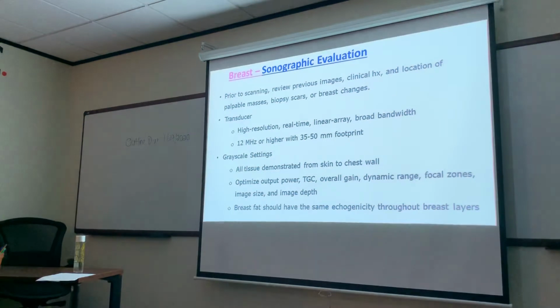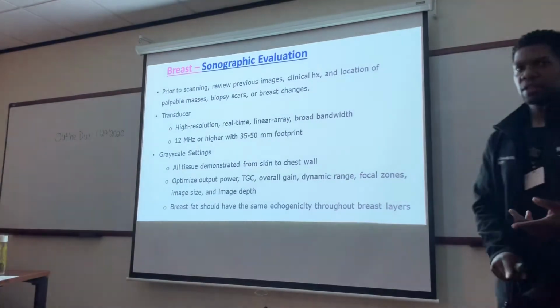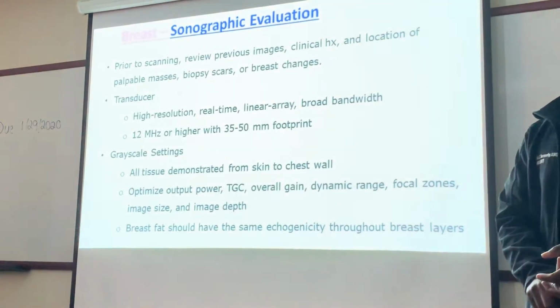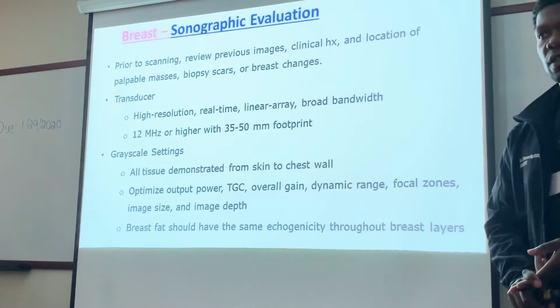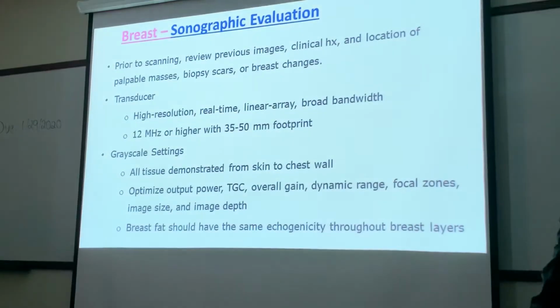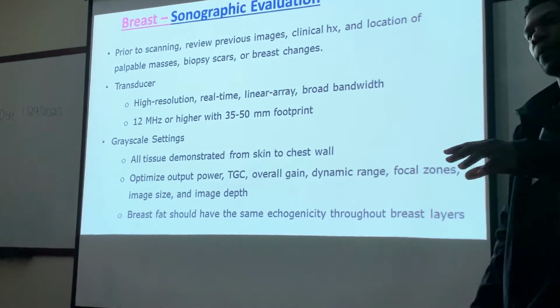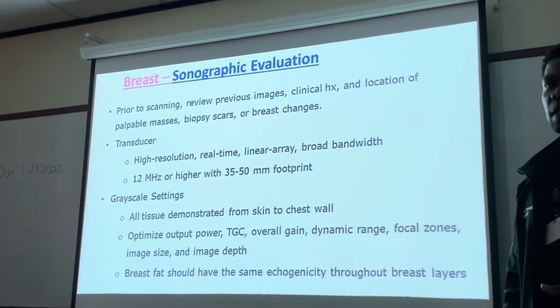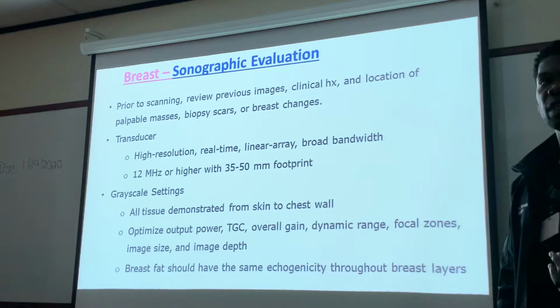Prior to scanning, of course, we're going to review all of our previous images, right? Like any other exam, we're going to look at the x-rays and whatever information is provided for the mammogram, every piece of information regarding the breast exam, so that we're able to best help this patient and identify what we need to look at. The breast can be a big organ, depending on the person, so you need to know what to focus on.